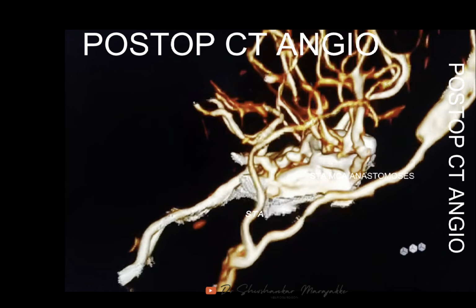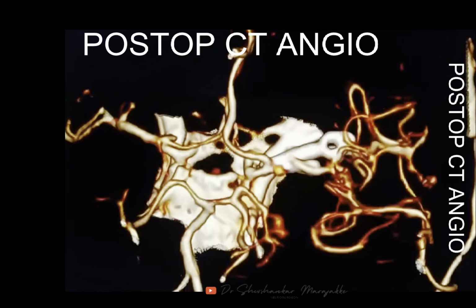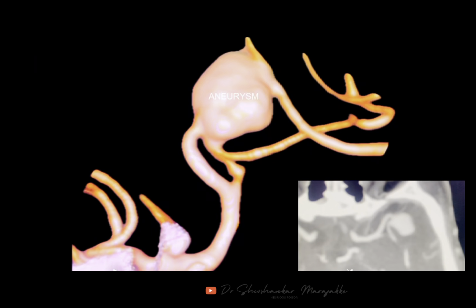Aneurysm is completely obliterated, and A1 MCA are clearly seen here, and there is no vasospasm, and no stroke is anticipated in this case because it is completely filling. So this is another case that we did.